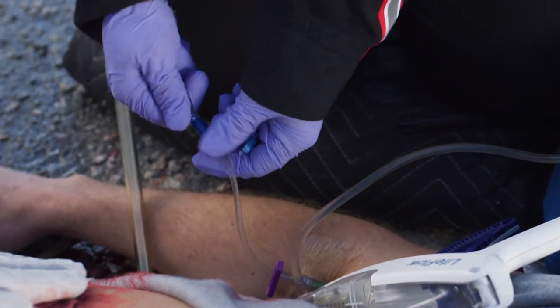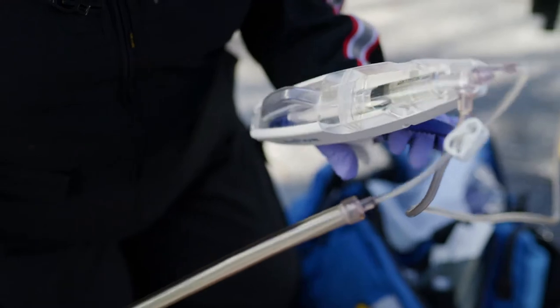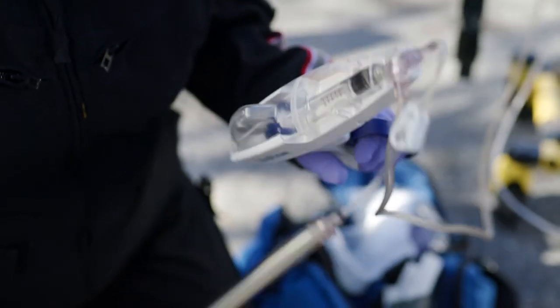Using standard aseptic technique, attach the Y tubing to the patient's vascular access. Recheck IV patency during the first few squeezes and throughout infusion.